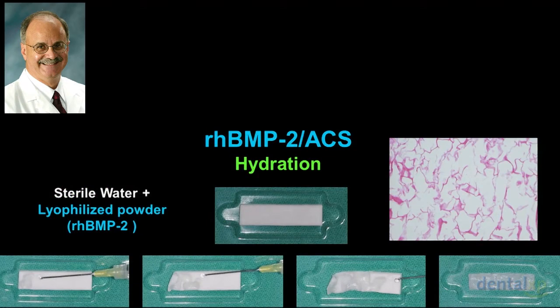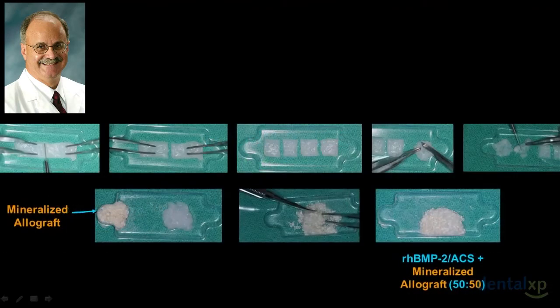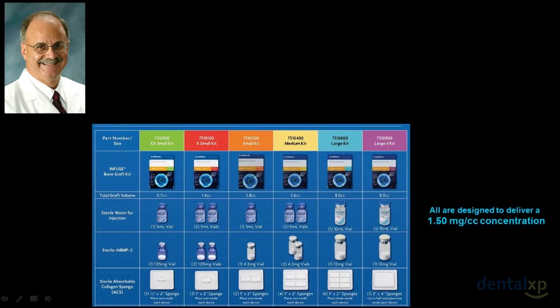Unfortunately, the matrix, which is a collagen sponge, is really insufficient to maintain space. And as you see on the far right, it's 90% air, really. As we reconstitute it with the powder liquid, letting it sit for 15 minutes, that activates the protein and in essence makes it very perfect for our use, as you're going to see. Comes in different sizes from anywhere from about $900 to $6,000. So got to be pretty selective and careful when you use it.